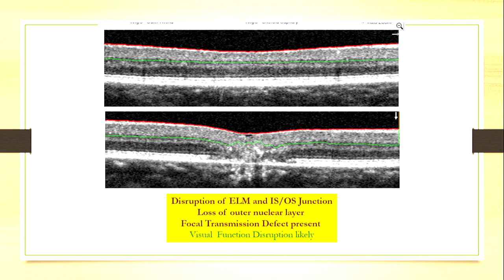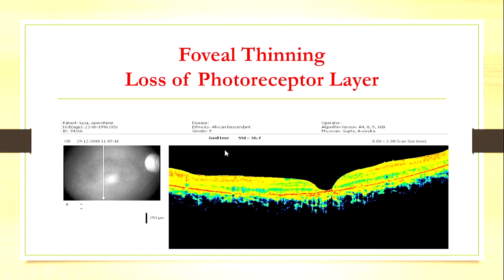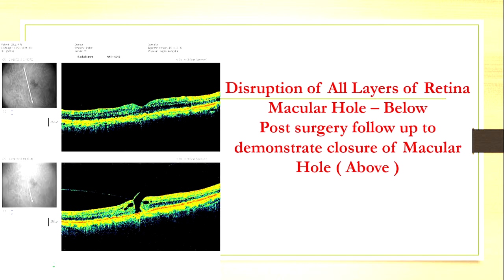So if you find a visual deficit and the patient is complaining, this is why he's complaining. Even in this case, otherwise it looks like the foveal contour is there, but if you look at the fovea there is thinning — the photoreceptor layer has been lost. Foveal atrophy is occurring. This would happen in patients who are having early geographic atrophy, and these patients will also have an effect on their vision.